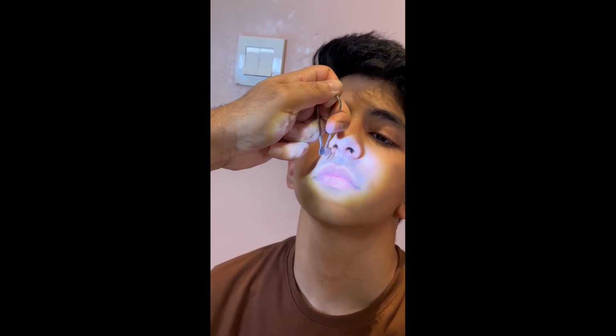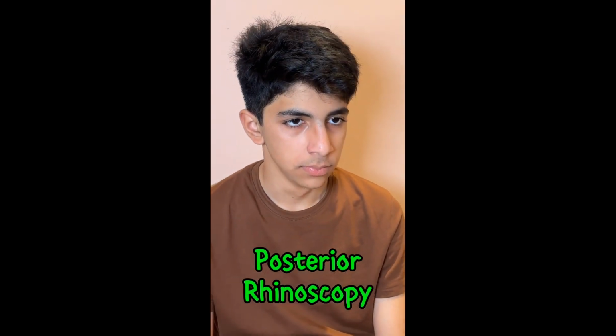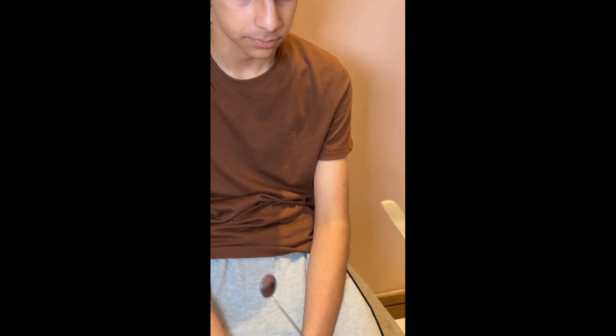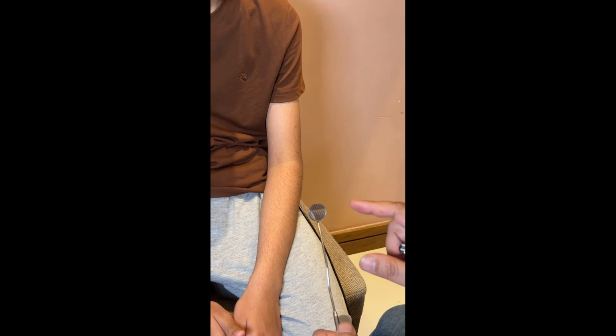And now we take it up. Now we will perform the posterior rhinoscopy. For posterior rhinoscopy, we need a post-nasal mirror and a tongue blade. We will heat the mirror side so the fog from the breath should not obscure our view. But we have to explain the whole procedure to the patient.